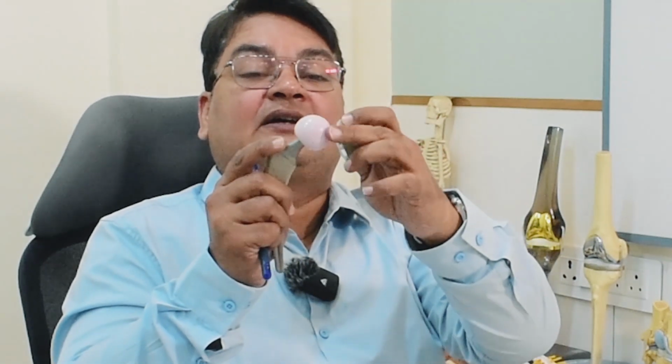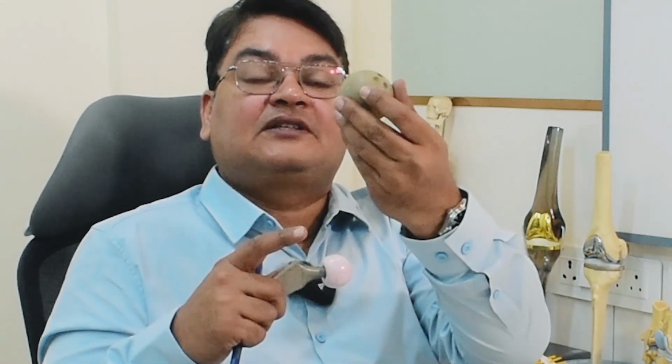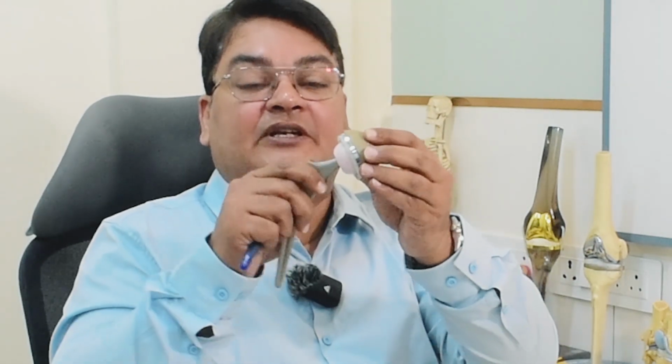The implant, this thing is known as the implant. So it has got parts. This is the stem, this is the collar, this is the head, and this is the bearing surface, and this is the cup bearing surface.